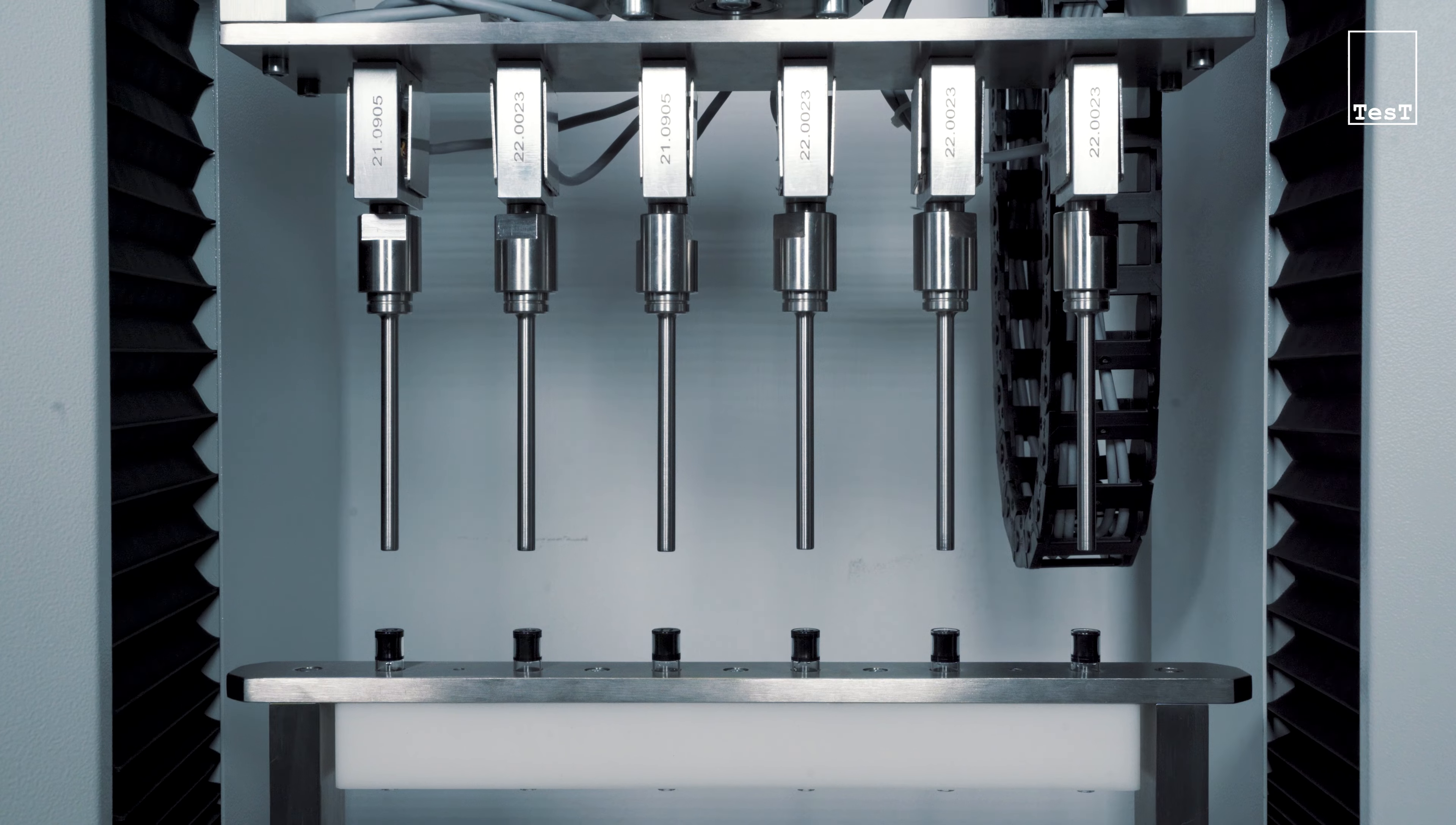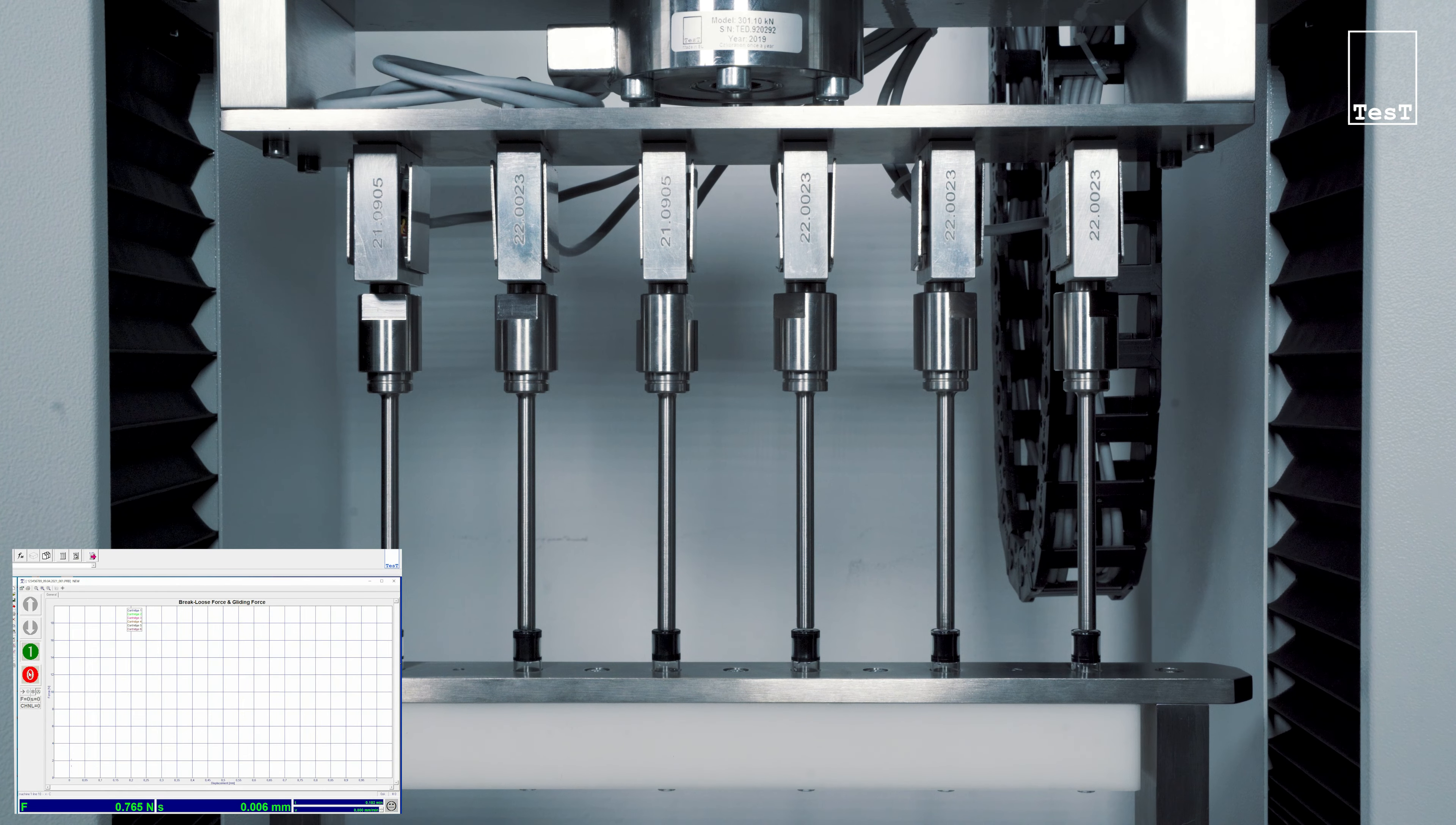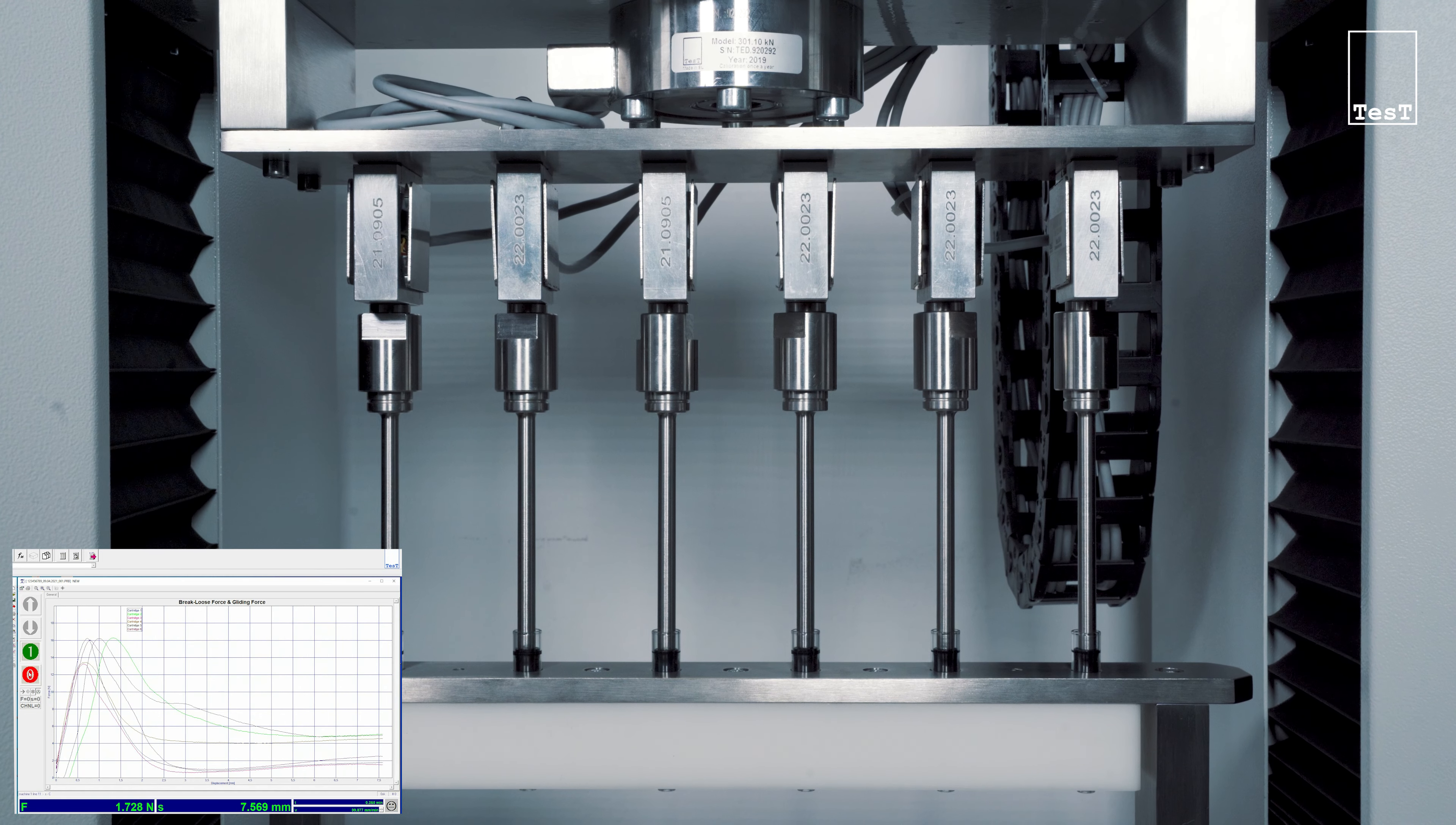and the leakage test, where a constant force is applied for a defined time. Each value can be detected in a load displacement diagram with a graph for each specimen for optimal comparison.